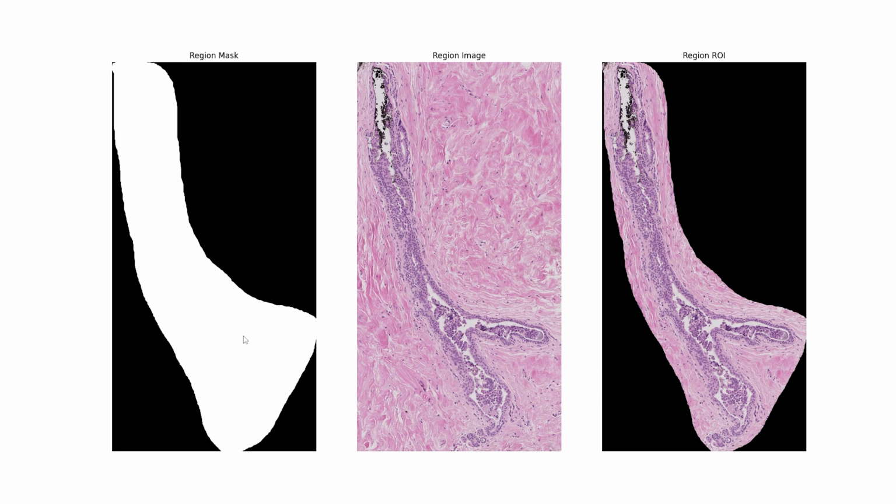So the bitwise AND simply multiplies each pixel here by 1, or by white, or by 255, and anything multiplied by white will be the same thing. But if anything is multiplied by black or 0, it will be 0. So this region is multiplied by black, which is 0 as a value, so the output is black or 0. By doing so, I obtained only this region.